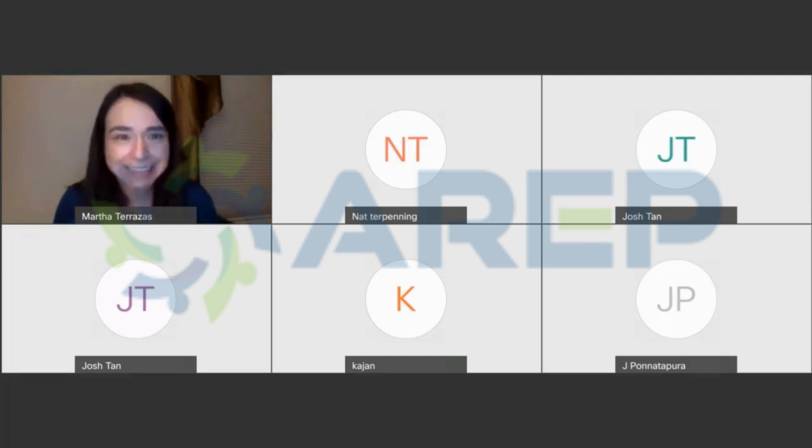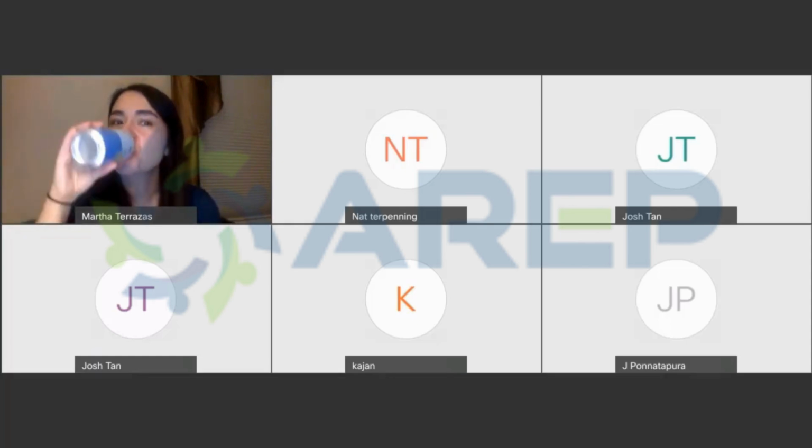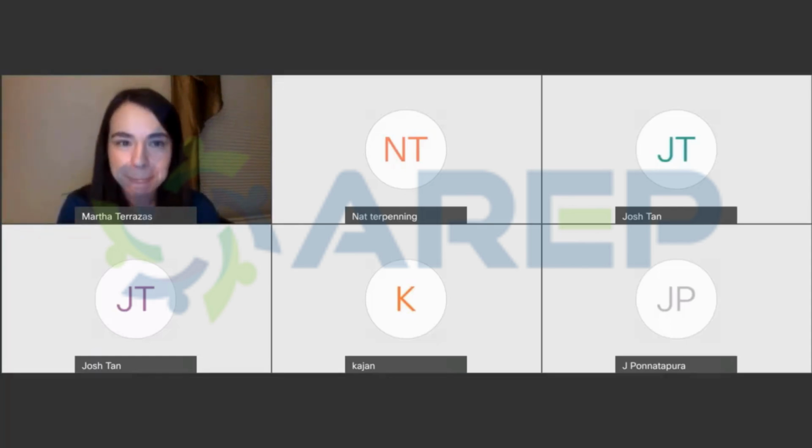Thank you. So I have a question. This is really a hot topic everywhere, AI. Is there any AI in hepatic imaging? That is really a hot topic at the moment.